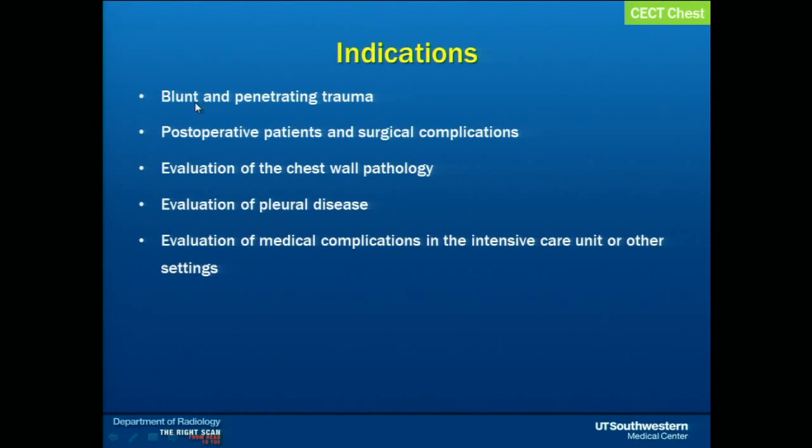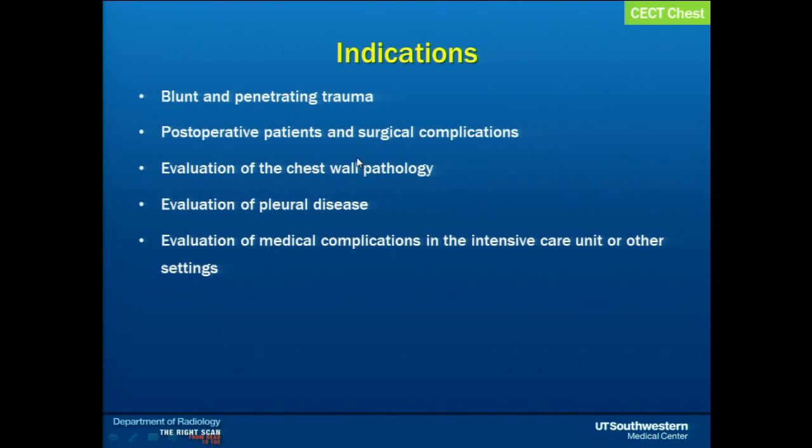It is invaluable to evaluate patients with blunt and penetrating trauma, post-operative patients and surgical complications, and evaluation of chest wall pathology and pleural diseases. Also for further workup of medical complications in the ICU or other settings, contrast-enhanced chest CT is invaluable.